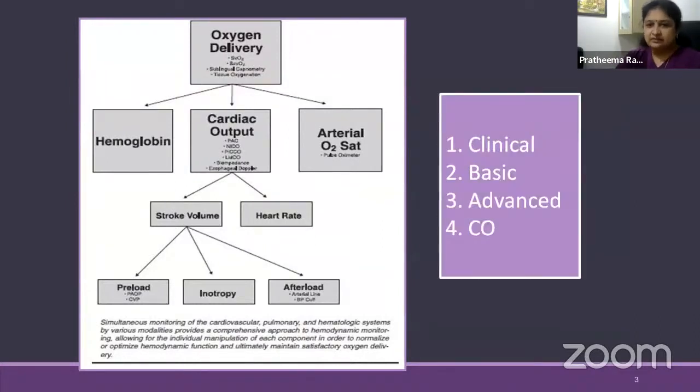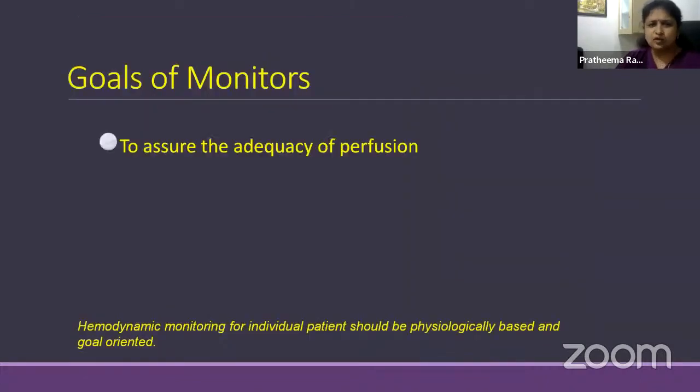So this is basically clinical basic monitoring, advanced monitoring, and cardiac output monitoring. So clinical, we know how we monitor. We'll just go through everything. So what is the goal of monitoring? What do you want to see? To assure the adequacy of perfusion. We are standing at the bedside. We need monitors to look into the patient. So monitors are a communication between the patient and us.